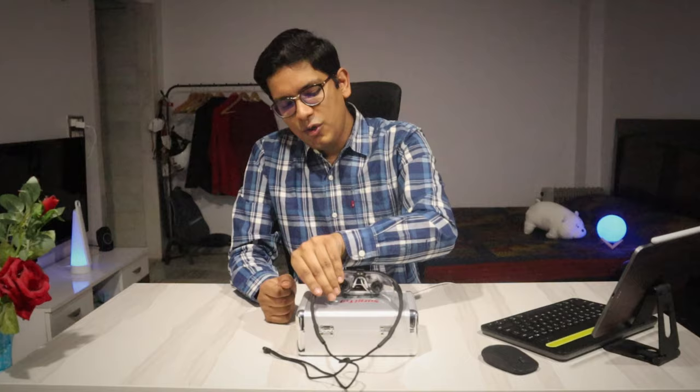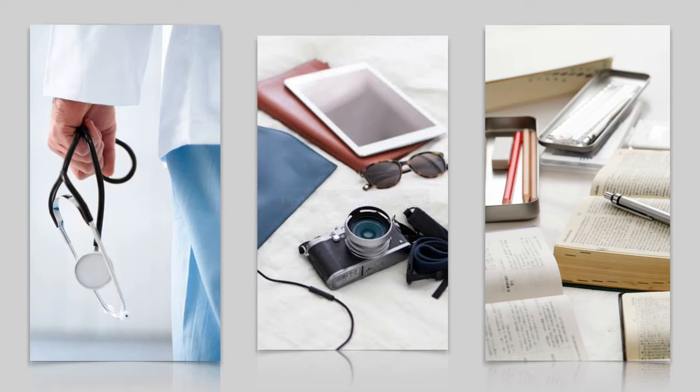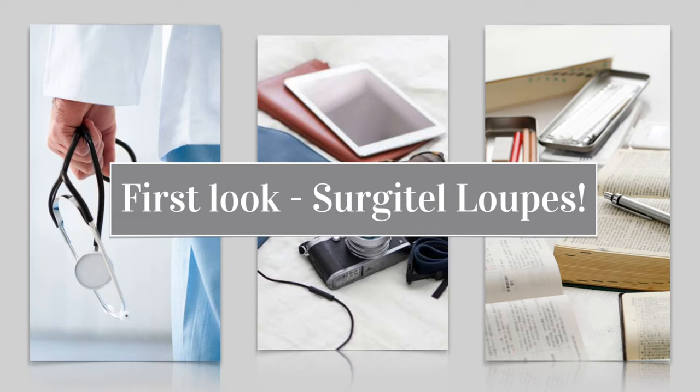If you're a non-medical, you might have seen these in movies and TV shows. So this is my surgical loop. This is made in the US by a company named Surgitel. In this video, I'm going to tell you everything about this — the unboxing experience, what exactly this is, and how do we use it. My name is Chizil. You are watching The Tech Doctor.